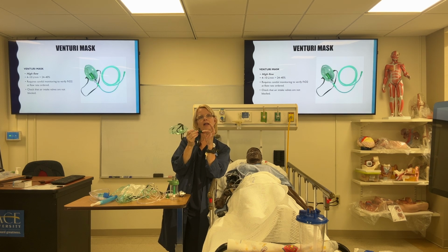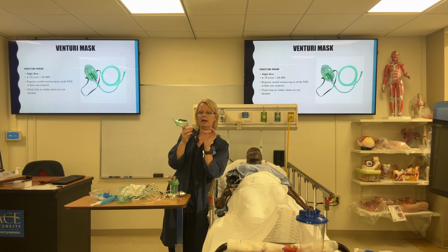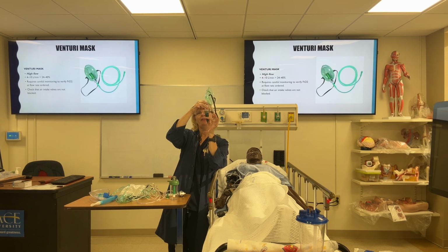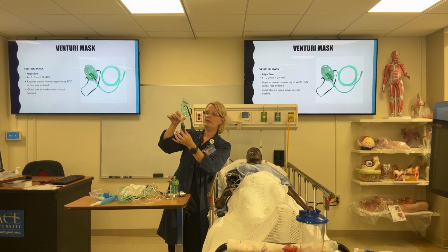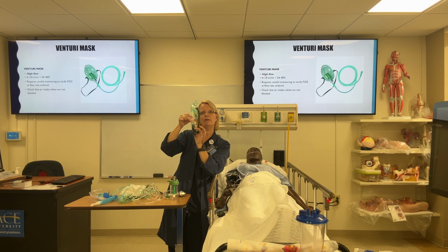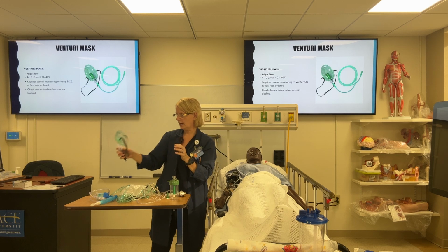And the way that the oxygen is mixing with room air is down here at the actual little device that's allowing me to set the FiO2 percentage rate. So as I turn the oxygen down, it is starting to mix with more room air. If I need to turn the oxygen up, then I'm turning the disc and it's closing off to room air. And that's how the patient is getting that control right through the Venturi mask, okay?